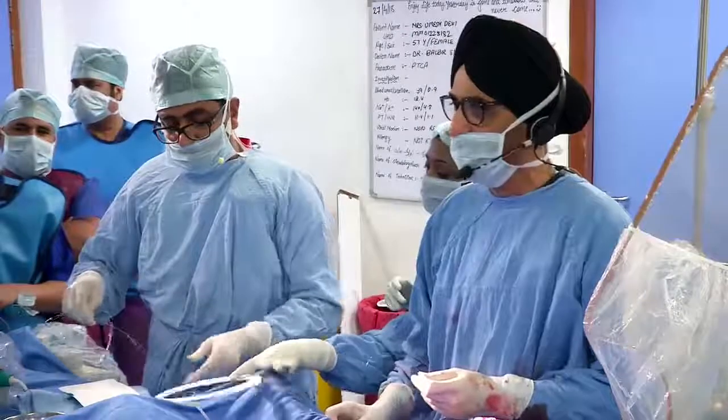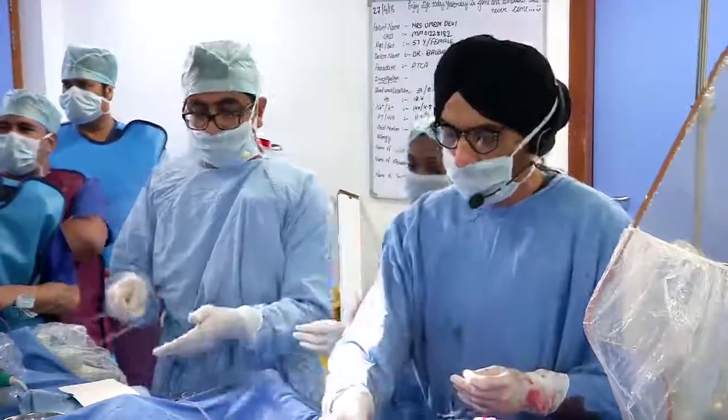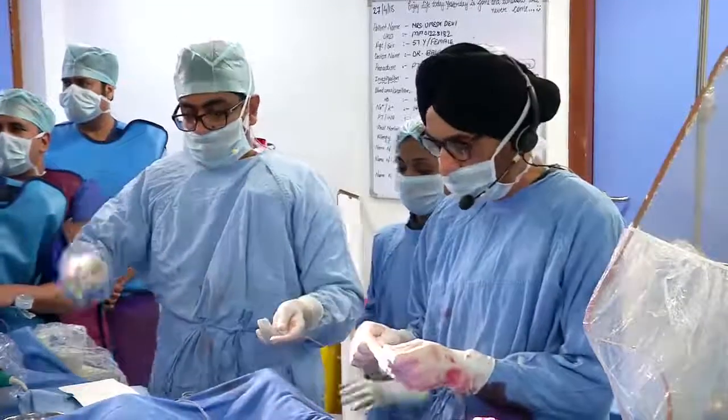Patient is comfortable, the saturation is 98%. We have the PA pressures intermittently, which we are checking, and they have not really increased.